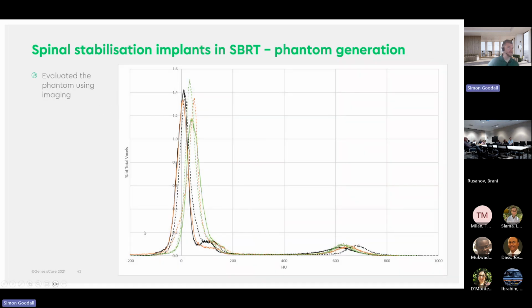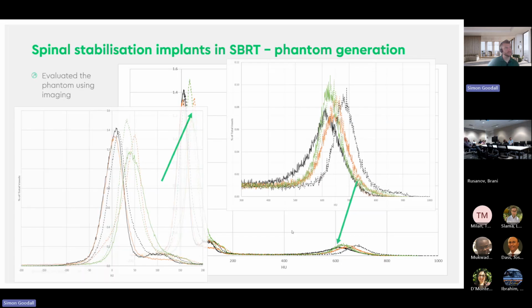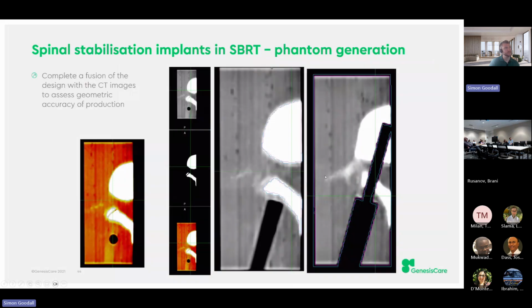We then did an evaluation of them. So we CT scanned them and looked at the Hounsfield units present in those items. And what we could see is that even though we were using the exact same settings and print quality, we still saw variations of plus minus 50 Hounsfield units in the mean value, with a relatively standard deviation. So the density just seemed to vary a bit with different prints. And similar stuff happened in the bone region, but the densities were quite comparable to bone, so we were happy enough to use it.